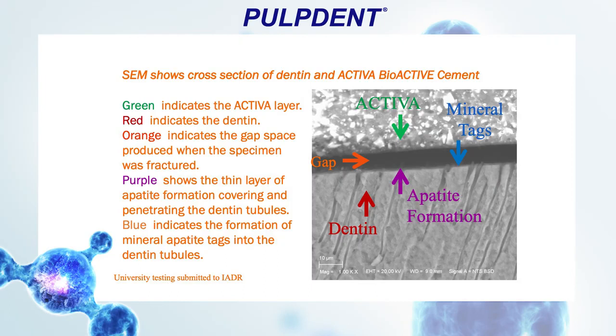So this is a nice graphic illustration to show what happens with a crown margin over time, where biofilm is present and acid metabolism and breakdown can cause demineralization of tooth structure, and as the passive cement may dissolve and degrade through time, these margins then become suspect and in early breakdown as far as their ability to maintain a marginal seal. Bacteria can then get underneath and recurrent decay can happen.